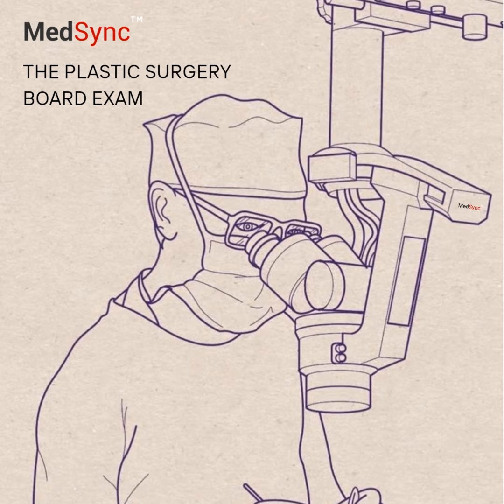Exactly. You tend to see less blood loss, lower infection risk because there's less dead space, and critically, reduced relapse. The soft tissues have had time to adjust so they don't spring back as much. Makes sense. Okay, let's walk through the actual process.